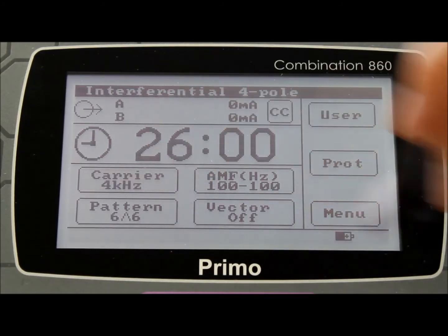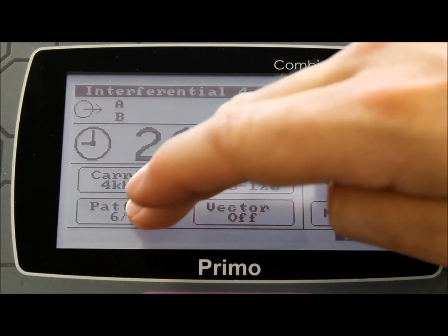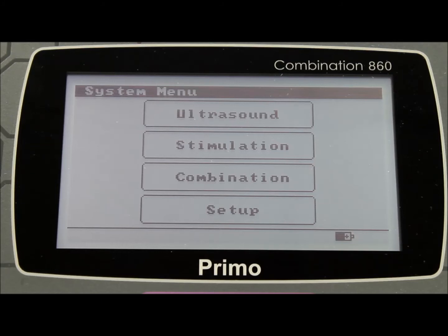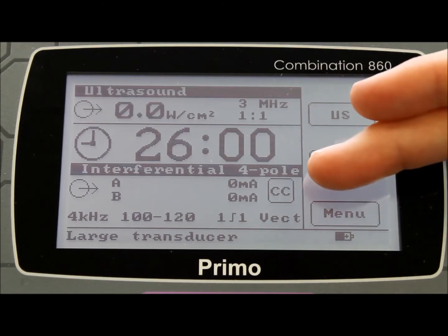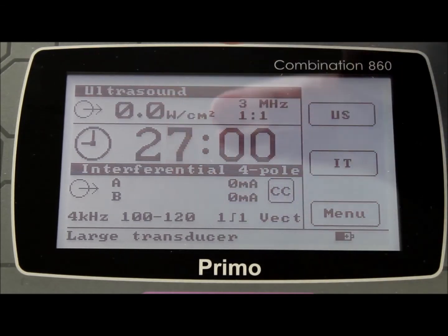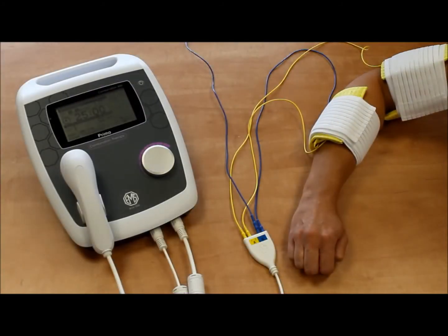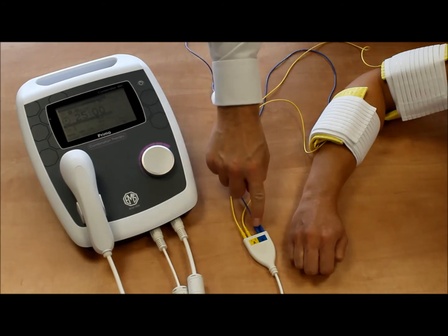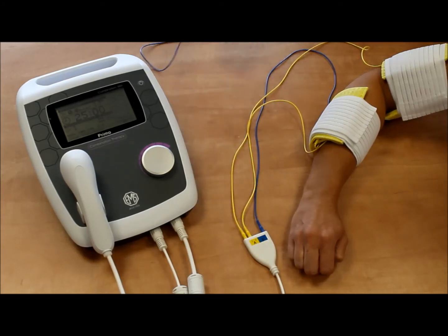You can also choose the AMF rate, the output pattern and whether to include the vector function. Once again, return to the main menu. If you then select the combination mode, you will see that the settings you've selected are automatically used for the combination therapy settings. You will not be able to make any changes to the settings other than to change the time — if any changes are required, please return to the relevant modality menu. With the combination mode, the ultrasound in effect becomes the fourth electrode. The inner blue terminal, shown as B1 on the label, becomes redundant for the purposes of combination therapy, and you should remove the cable as a precautionary reminder.